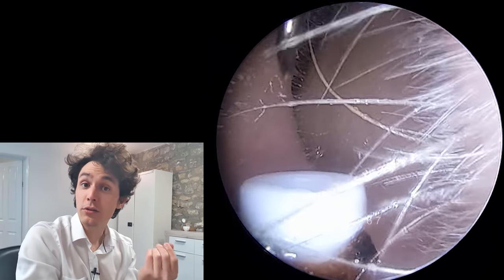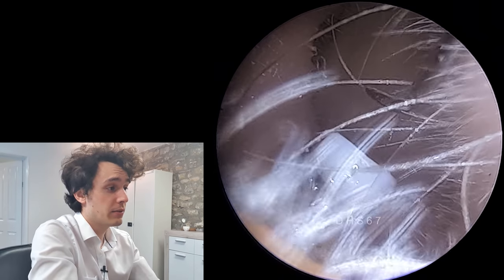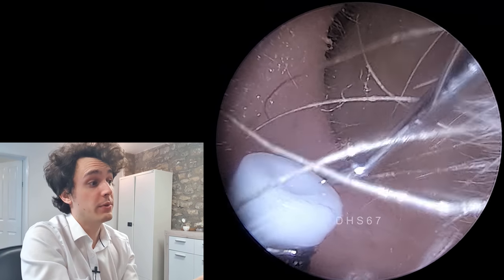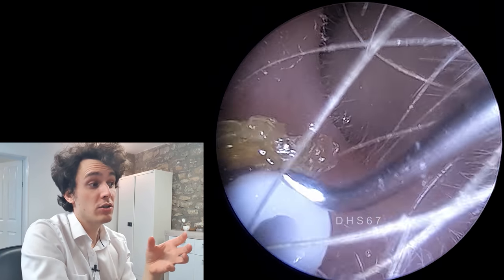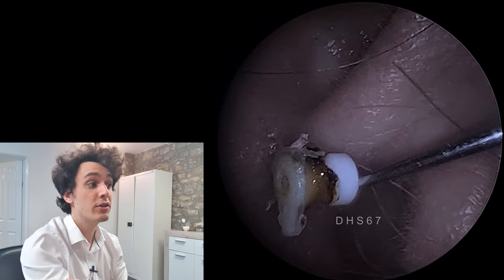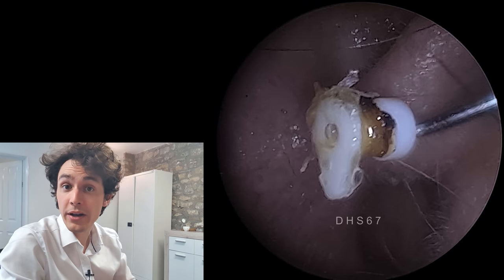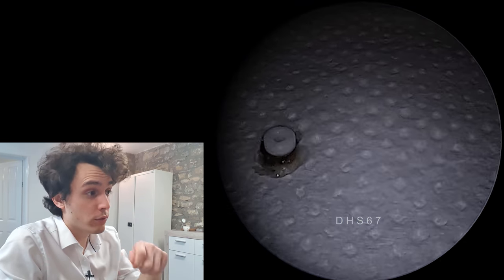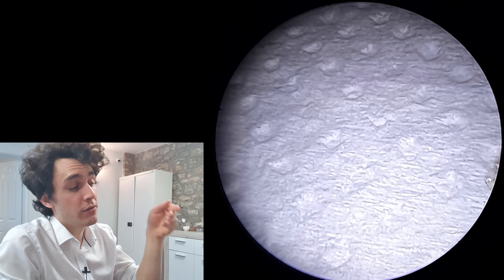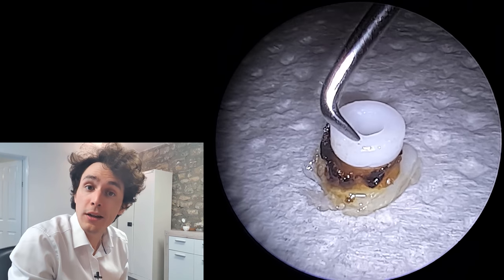I'll give you a good closeup of the grommet so you can see what it looks like. Going back to the reason why somebody would have a grommet — your eustachian tube is what connects your middle ear to the back of your nasal cavity, your nasopharynx. I'll link you to an anatomy video I did quite recently where I draw out all the structures. Essentially, because the grommet has a hole in the middle, you're allowing ventilation through to that middle ear, which is lined with a mucosal lining.